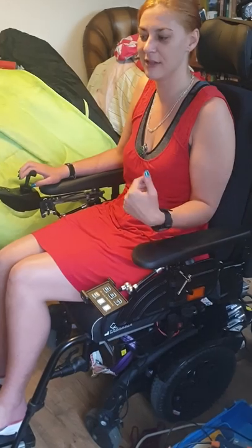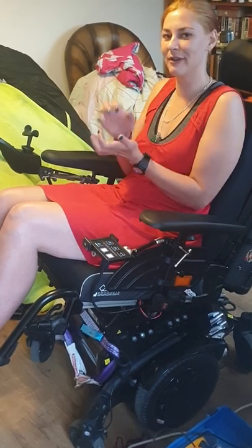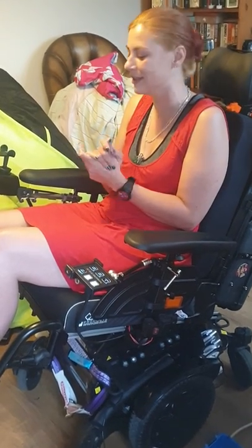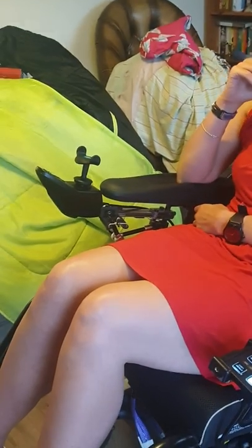But equally, it means I can take the pressure off my hips by tilting it back slightly. One of the main problems I found with Pegasus is that if I'm directly on my hips, it causes an immense amount of pain and makes what little mobility I have left incredibly difficult. And it also has a horn, but the horns are rubbish — they always are. It's better than it used to be but it still sounds a bit like the end of a microwave.